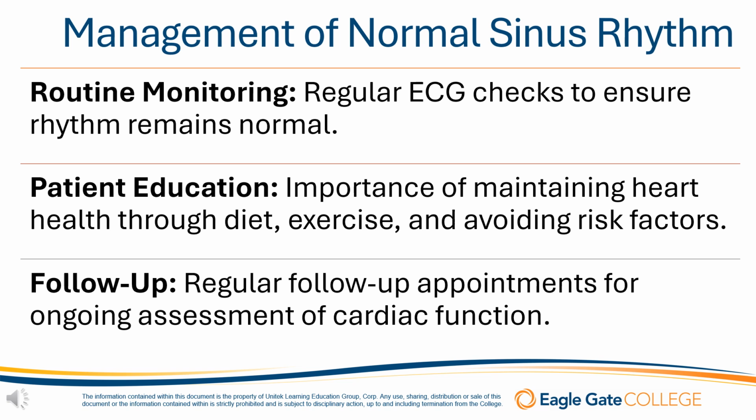This can be helpful for patients who have a history of arrhythmias. Holter monitors or event recorders can provide continuous ECG monitoring over extended periods. This can capture any transient abnormalities that might not be seen during a routine ECG.